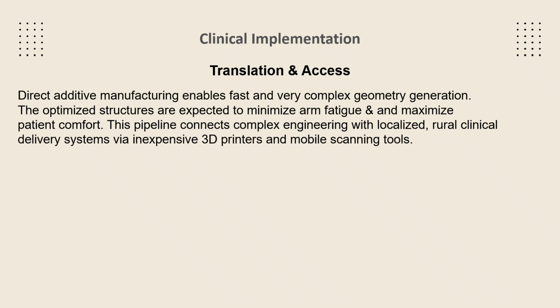The net result of this optimization is an organic, very complex web geometry orientated strictly along internal stress pathways. This methodology shows how we translate this complicated digital data to real-life clinical implementation.